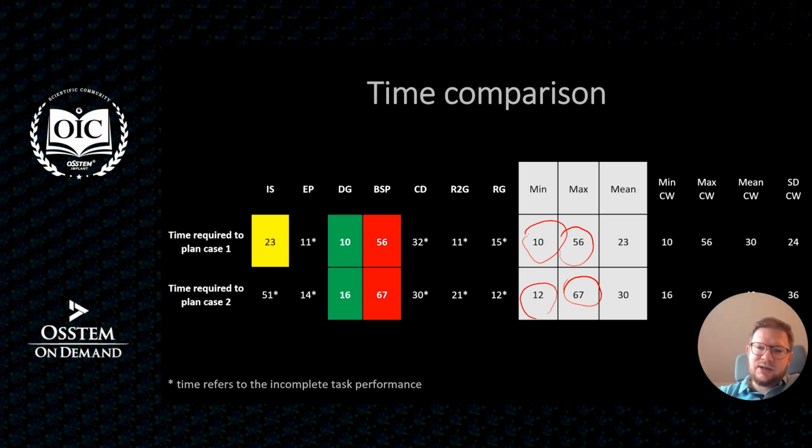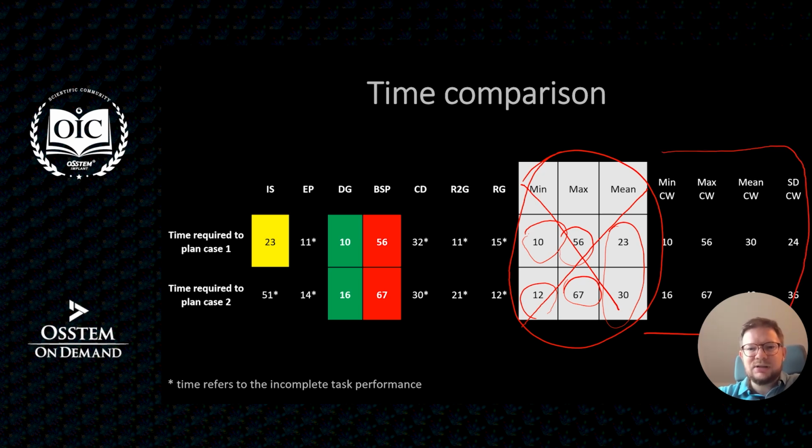The mean, again, is quite good. However, that part is not appropriate, and we need to look more at that part, which is CW, the complete workflow.